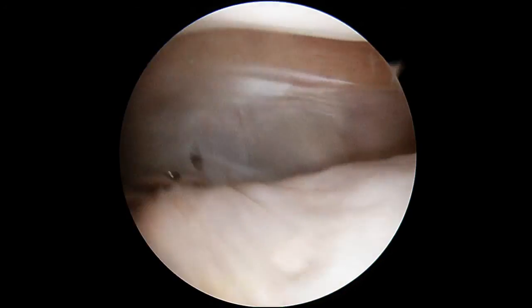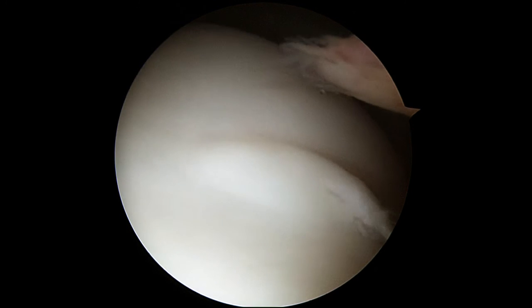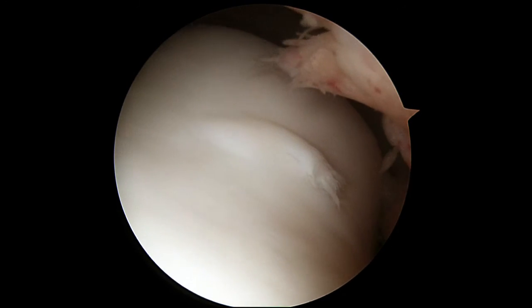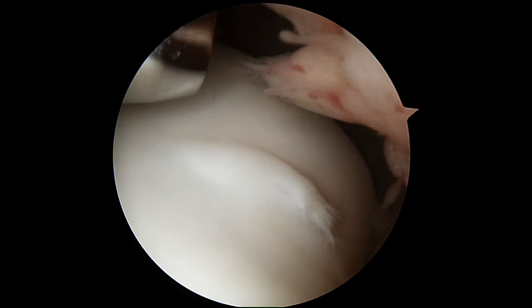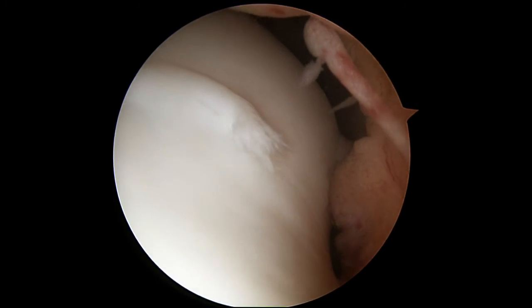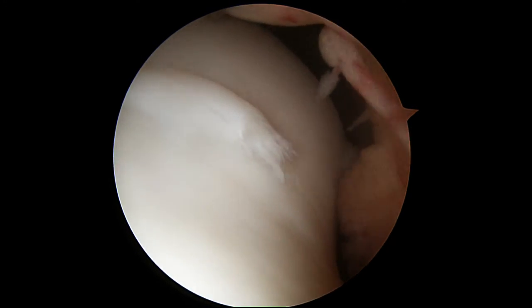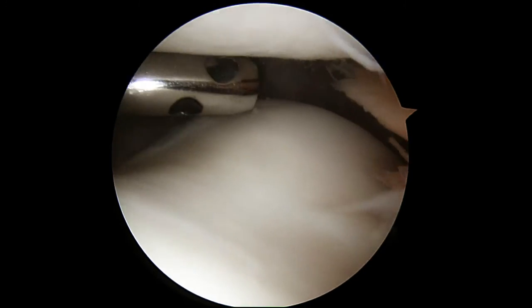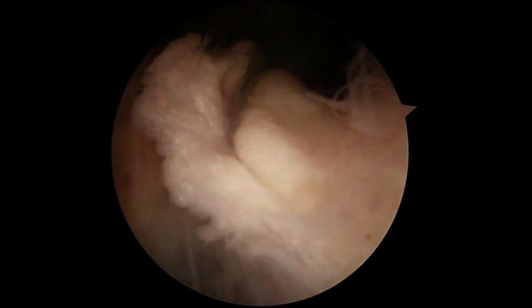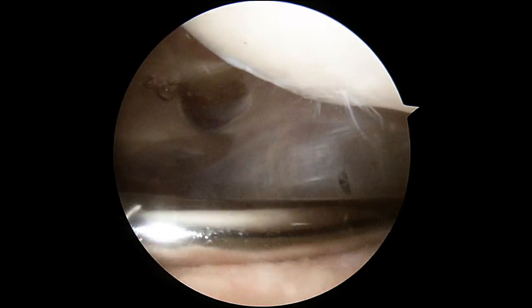The kneecap slides up and down the groove on the thigh bone, or the femur — right there. See that little blister in the cartilage? A little flap in a blister. Again, it's pretty small, but that's from getting down into the squat too many times, so that can irritate it a little bit. We'll clean that up and hopefully that'll help.